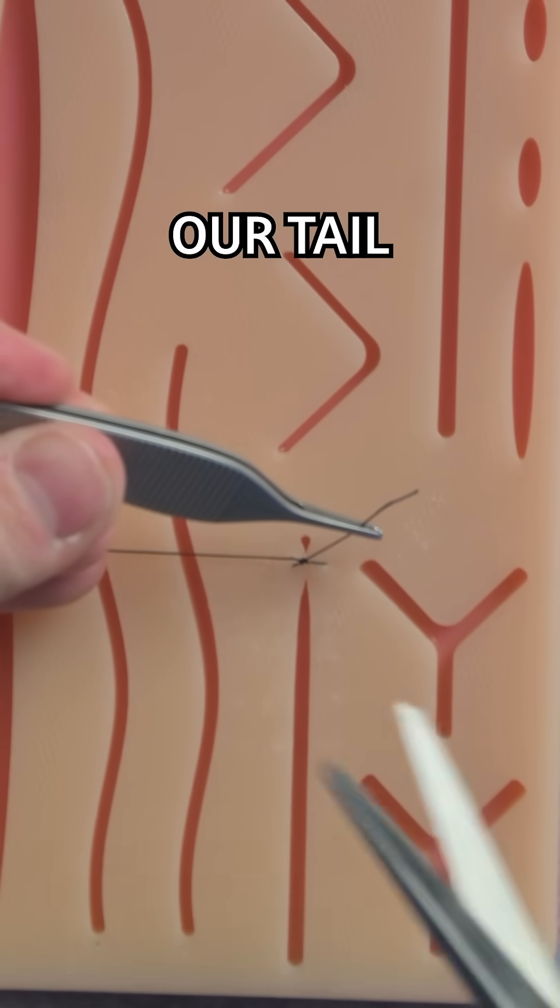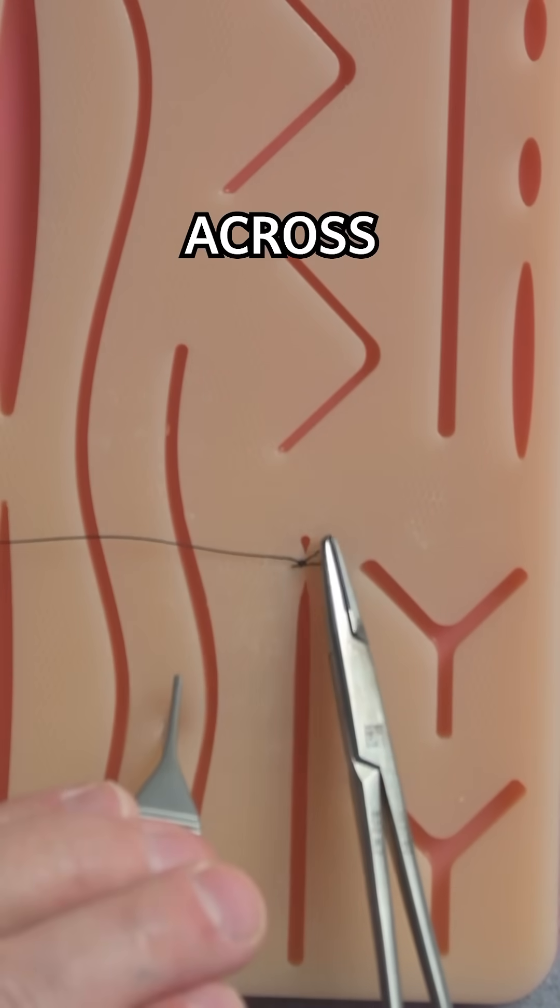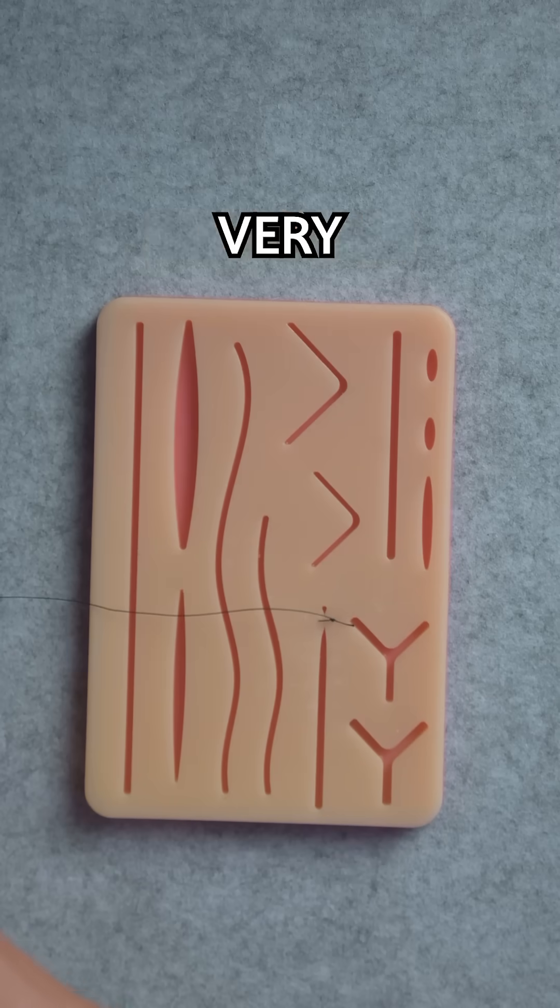Couple of things at the beginning. We need to cut our tail and pull our stitch across to the right side at the very beginning.